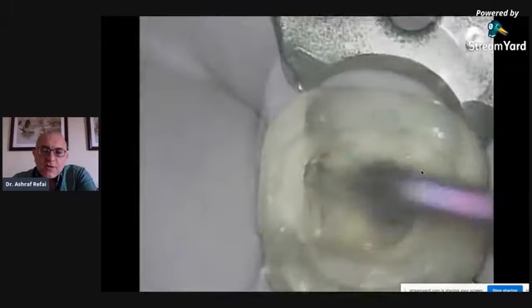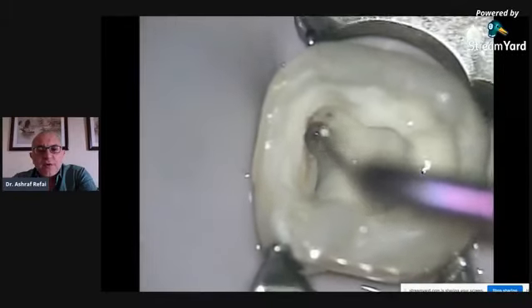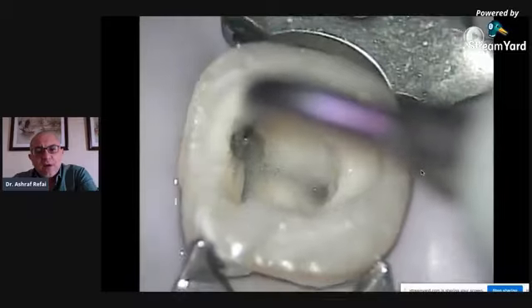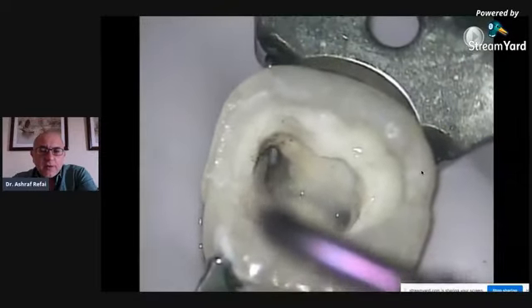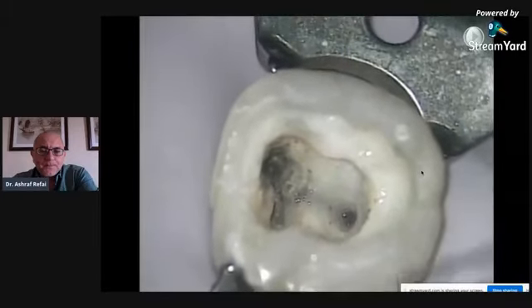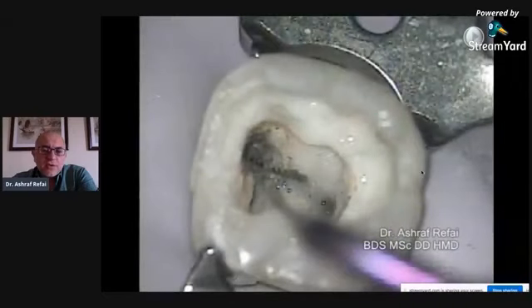So here, this is a case I did a very long time ago. It was about maybe 12 years ago. And you can see from the level and the graininess of the video that it was a very long time ago. We didn't have the high definition cams that we have now. And this was an instrument fractured in the middle third. And in this case, I created a platform, and I started applying my ultrasonic instruments laterally to loosen that instrument from the canal. And hopefully it should pop out anytime soon. Here you go. Yeah, so that's use of ultrasonics.